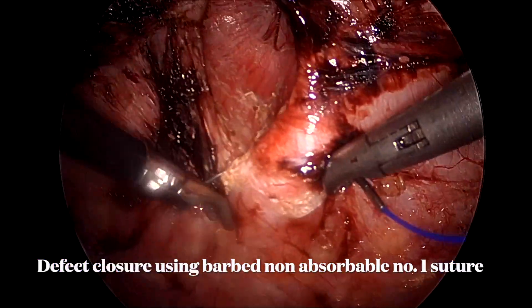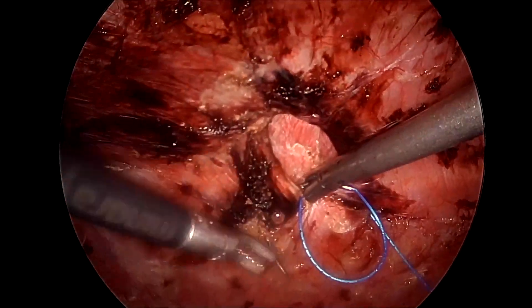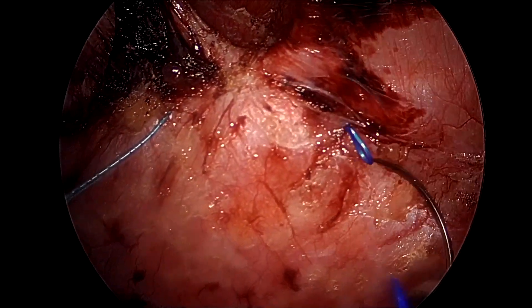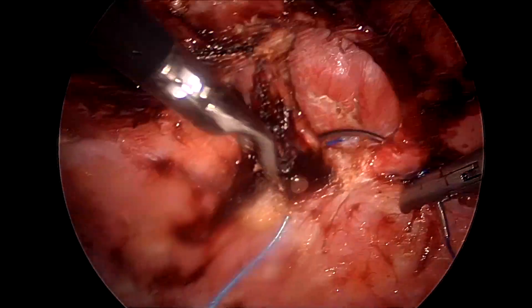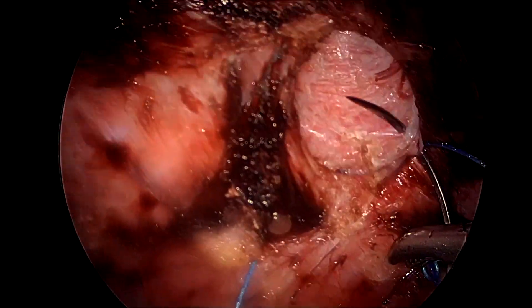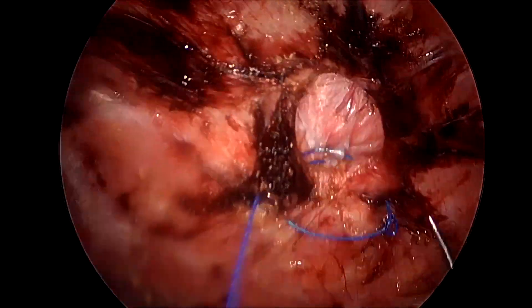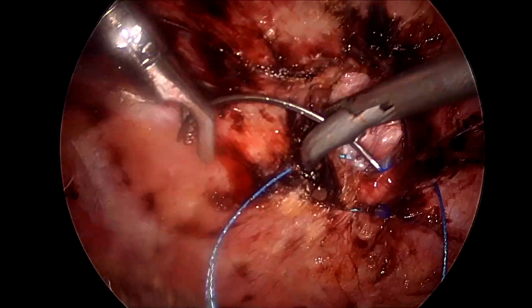We are using barbed non-absorbable number one sutures, 15 centimeters in length, to close the hernial defect. We try to incorporate some portion of pseudosac while taking these bites, but at times when we feel the skin is too thinned out and it might cause puckering of the skin, we leave out the pseudosac. We do not reduce the pressures while closing this defect.